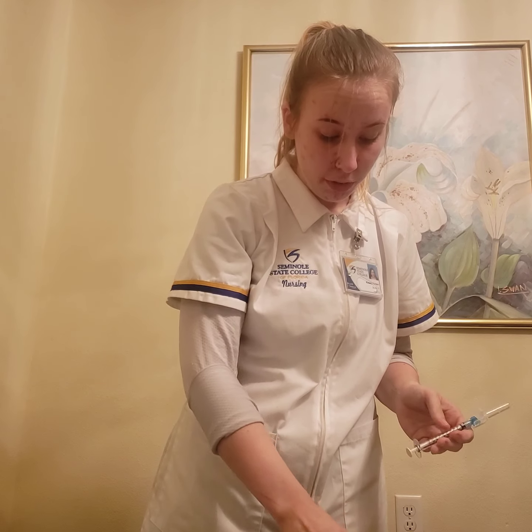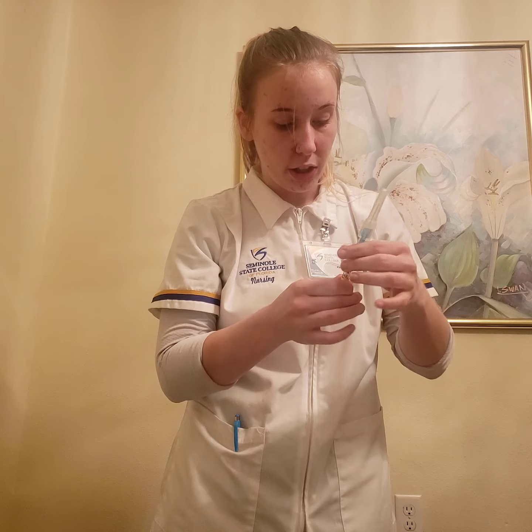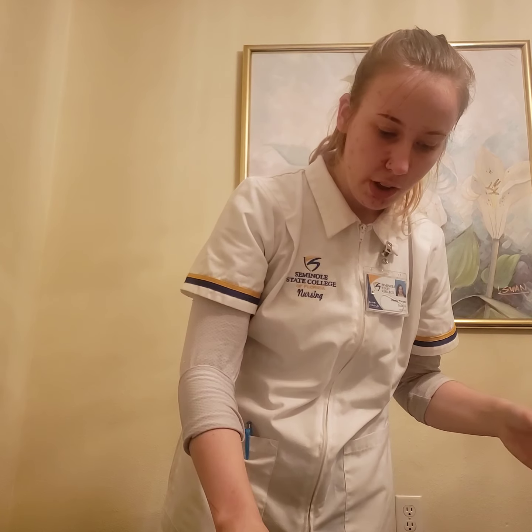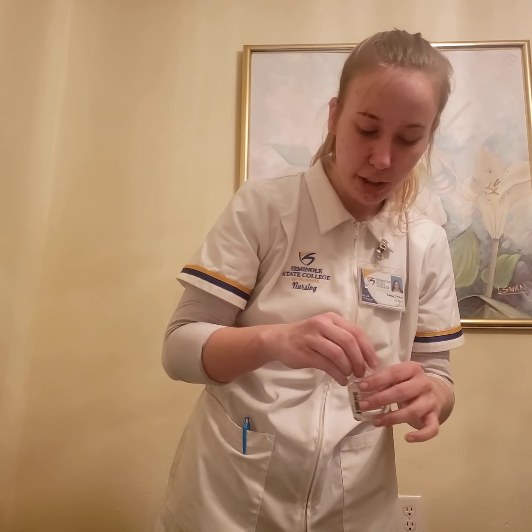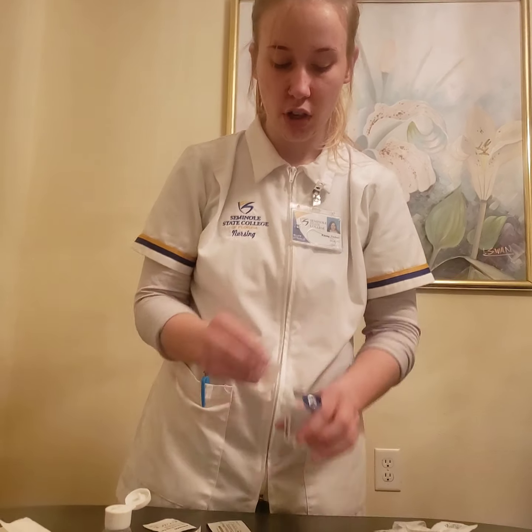And I'm going to go ahead and label this with the flu vaccine so that when I draw it up, it'll be ready to go. And when I go to my patient's room, I can verify and know which one is which. So I'm going to go ahead and get my flu vaccine ready. I'm going to need to scrub the top of the vial 10 to 15 seconds and then let it air dry completely.